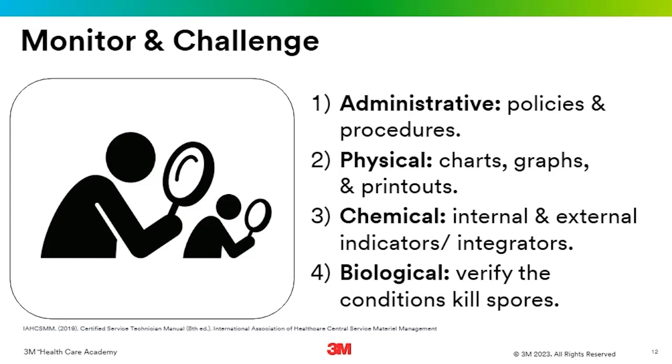Another monitoring is physical monitoring. And I think a lot of the times we overlook it just because we're so used to having it. And also because a lot of us don't know how to interpret physical monitors. And a great example of that is your printout from your sterilizer. That is a physical monitoring device.